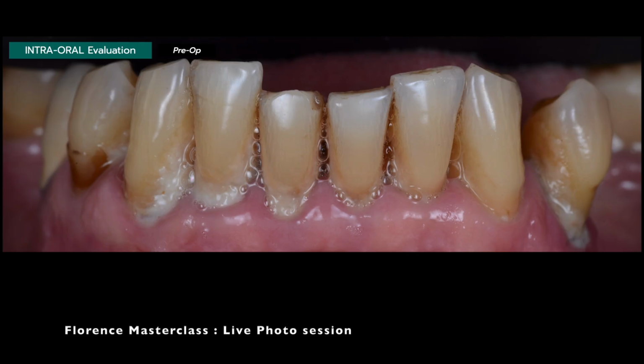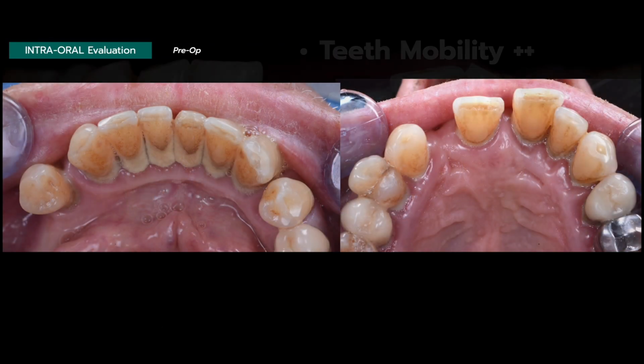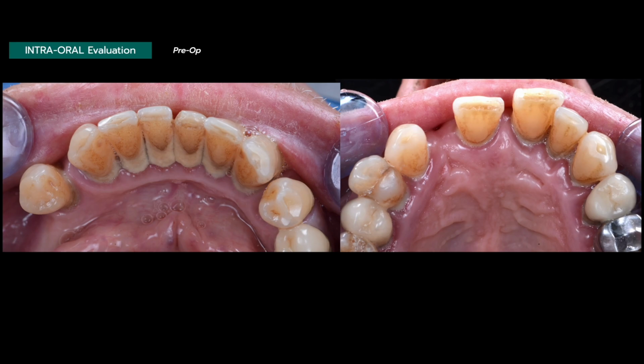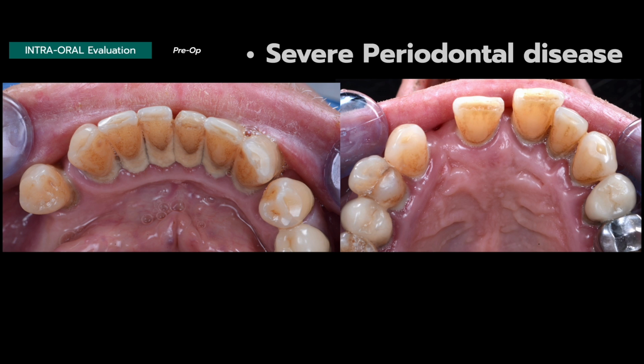At the end of this consultation, through the photos and pictures, we are able to educate the patient about what is going on in his mouth. We will take the photos and discuss with the patient live, and then we will also use the new tools with AI for the analysis of the photos, the radiographs, and the explanations.